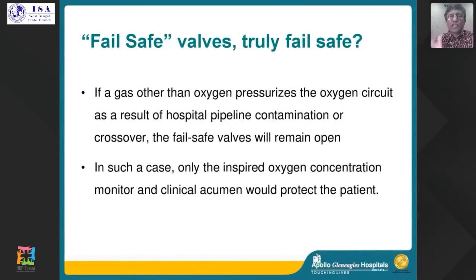Are they absolutely fail-safe? Again, it cannot be. Imagine that scenario. If you have an oxygen gas pipeline which is not filled with oxygen, or an oxygen cylinder which has not been filled with oxygen or is contaminated, the pressures are all right. It is all about pressures, mind you.